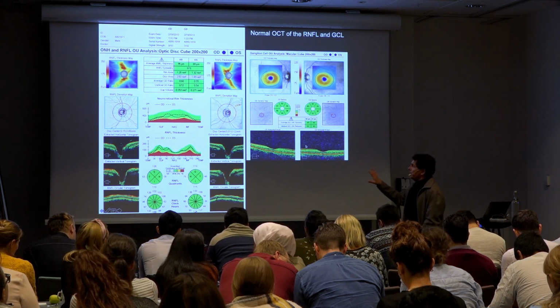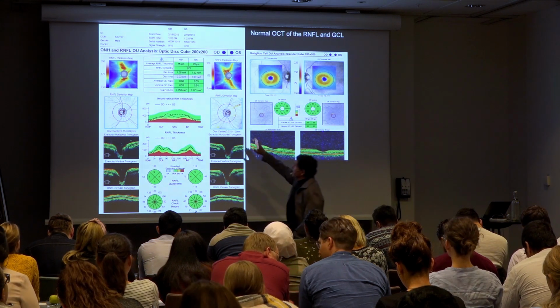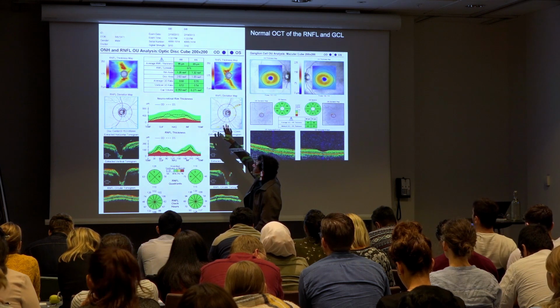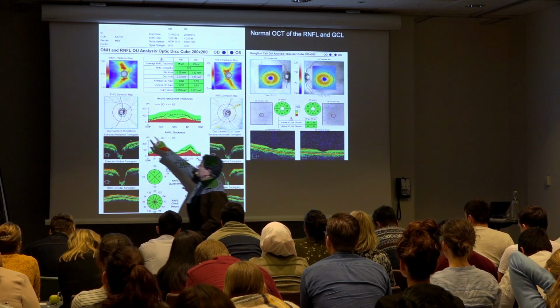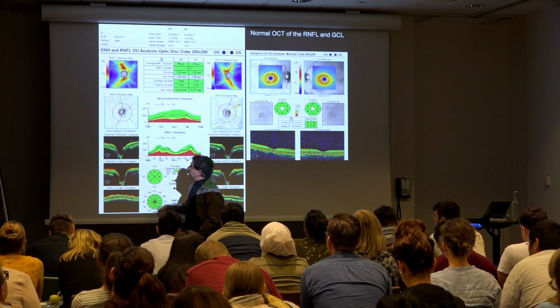We've already gone through the normal OCT, and just a couple things. What's the information you've got at your disposal? Remember, you've also got the optic disc analysis, which gives the disc area. So this black line, how do they define the disc area?